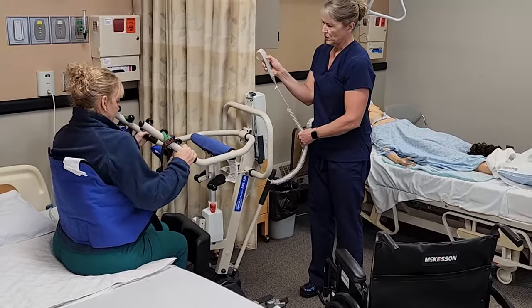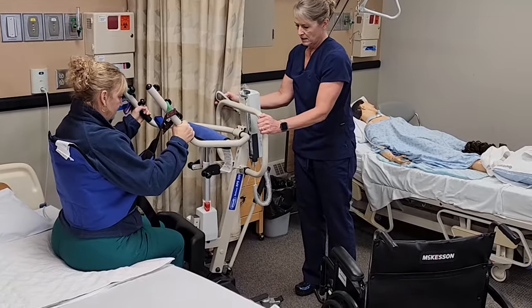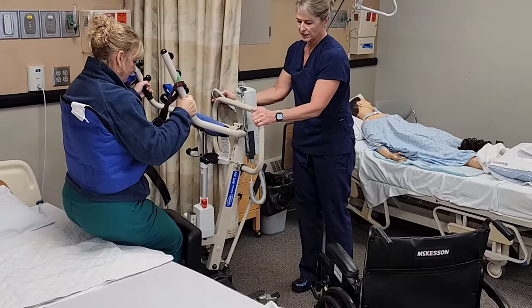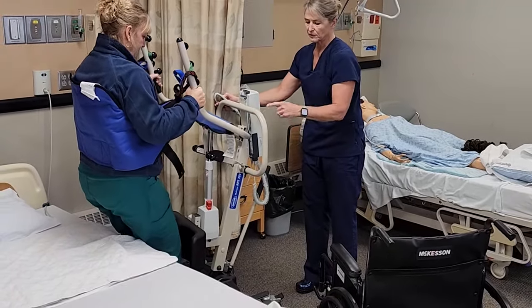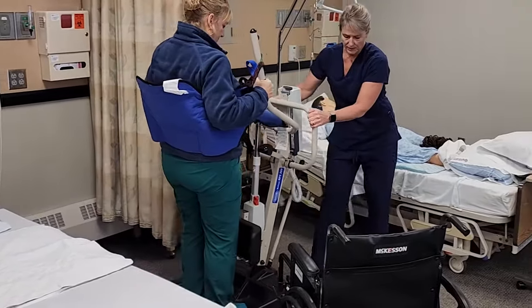There's a remote on the lift with the up and down button. Besides moving her from her bed to her chair, it's also helpful in dressing — we could put her pants on up to her knees and then have her stand up and pull her pants up while she's up.